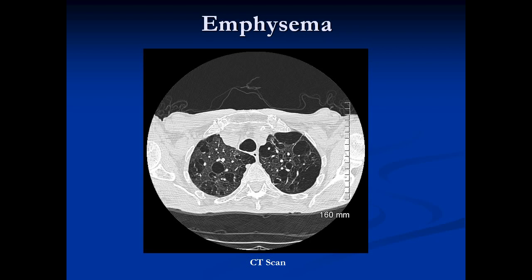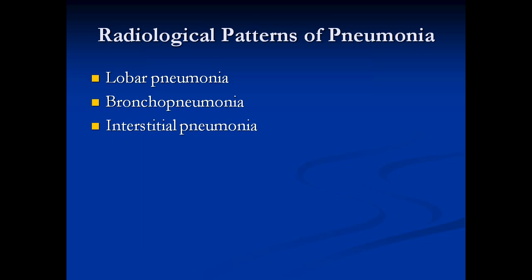Here's a CT scan example of emphysema, which shows holes in the lung — some of these are bullae and others are areas of emphysema. The last topic is the radiographic patterns of pneumonia. Basically, there are three different patterns of infection of the lung: a lobar pneumonia pattern, a bronchopneumonia pattern, and an interstitial pneumonia pattern. All three are distinct, all three are caused by different agents, and it's something you want to remember when looking at a chest x-ray.